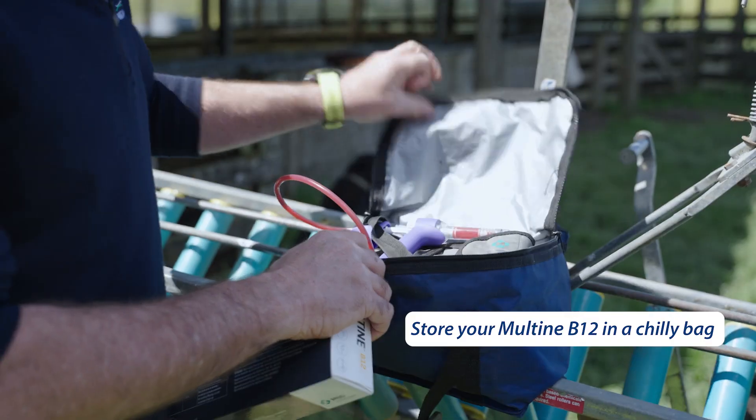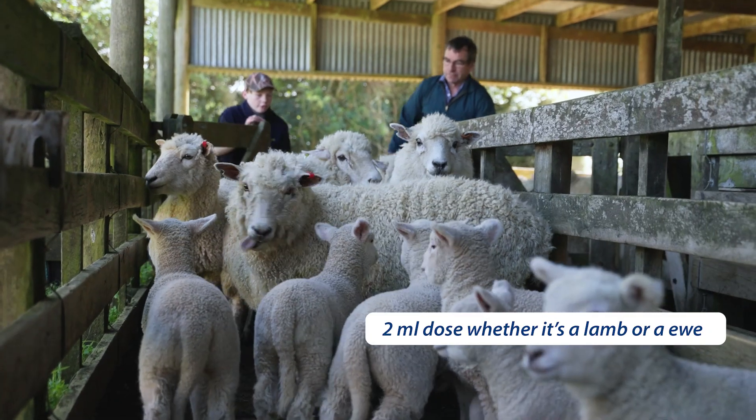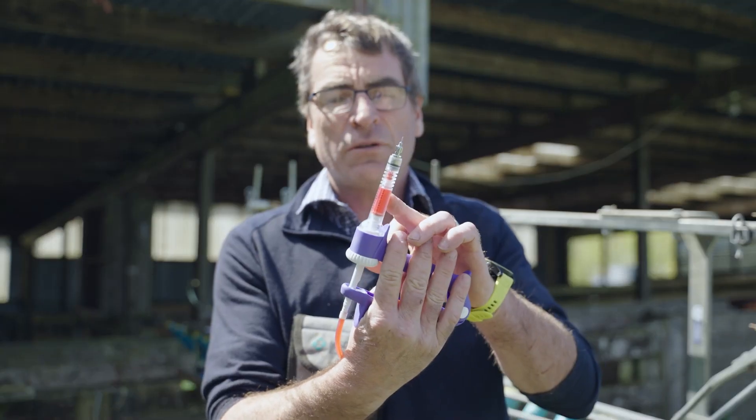To get ready for vaccinating today, we've got our Multine B12. I brought it up here in my chilly bag. I've got it in my little pouch so it's safe there out of the way. The dose for a lamb is the same as for a ewe — it's two mils — and I've set my gun up here to give two mils.